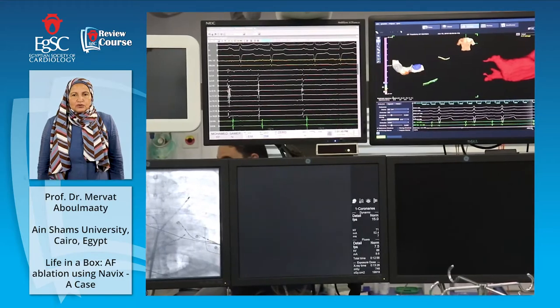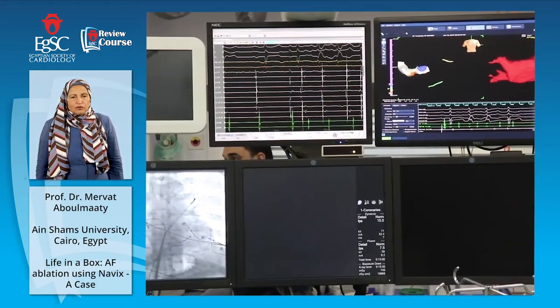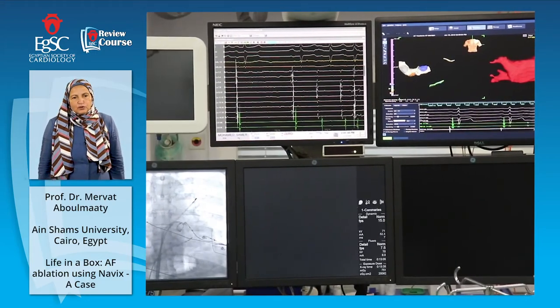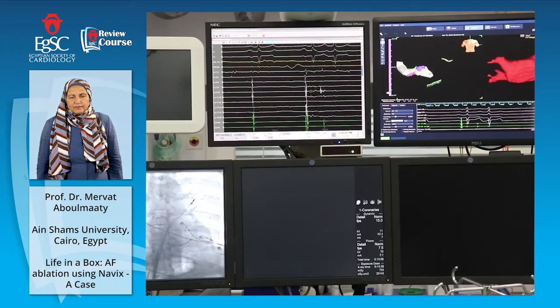And then we start to introduce the catheters. We have 2 sheaths now. If you look at the fluoro down, one, the ablation catheter is on the left superior pulmonary vein and the circular catheter is moving now into the left atrium.